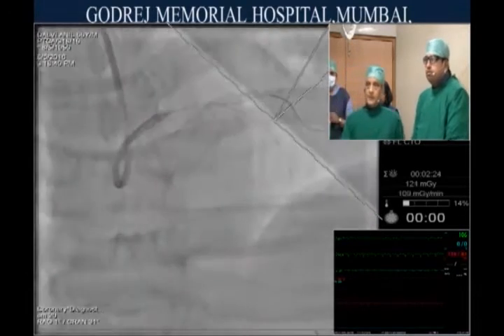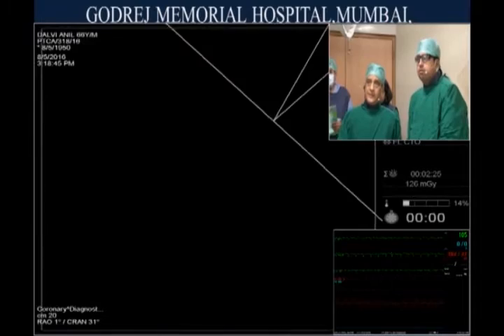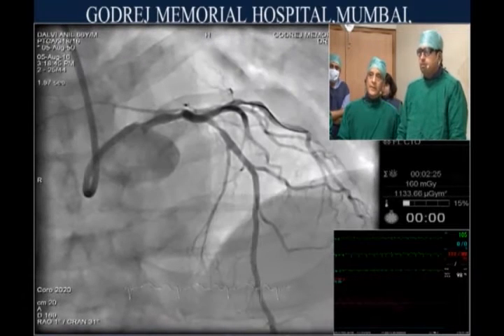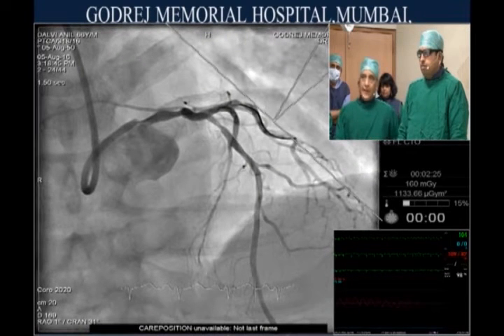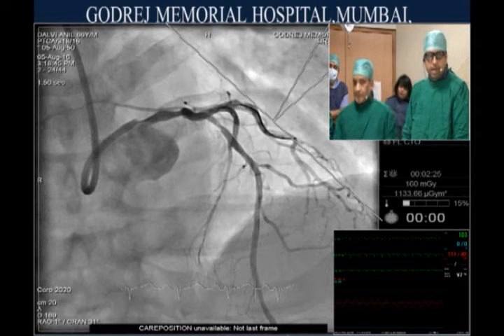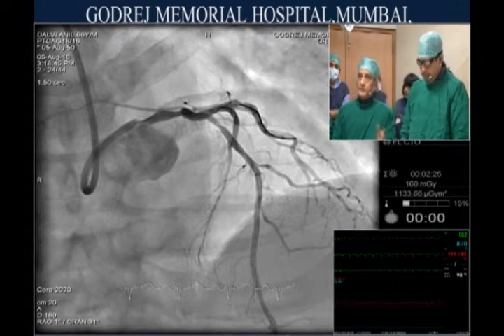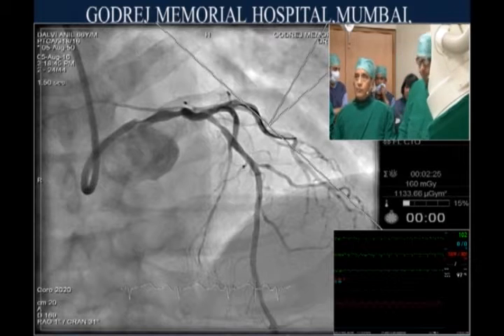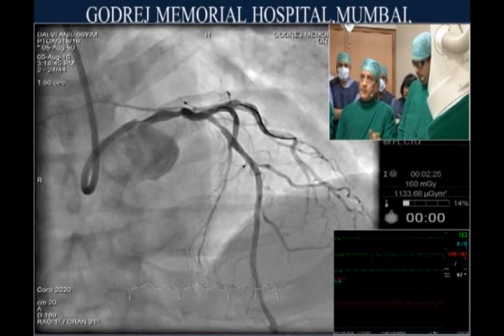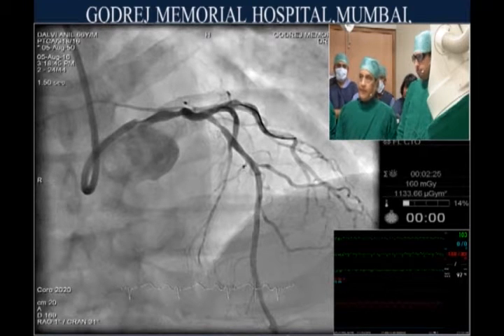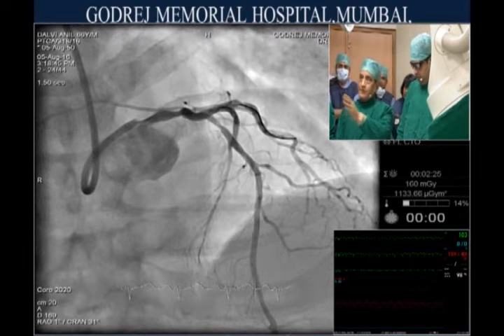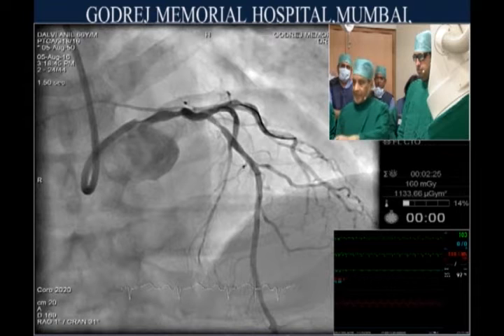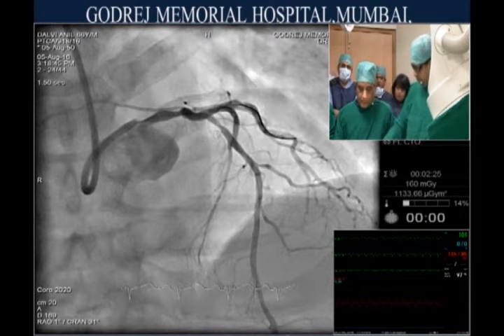On AP cranial view, there is a tighter lesion in the LAD and a moderate lesion of the circumflex — this is truly a distal left main bifurcation. There is also disease at the ostium of the left main. When you put the guide in, it damps. In the past, these lesions were left alone but patients returned with worsening ostial left main disease. Our goal is to cover the ostial left main. The plan is one stent from the septal region through the LAD and left main, and a second stent into the circumflex, which was very tight on the other view.